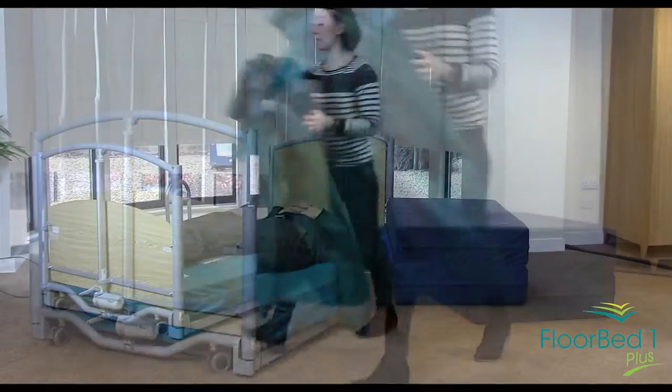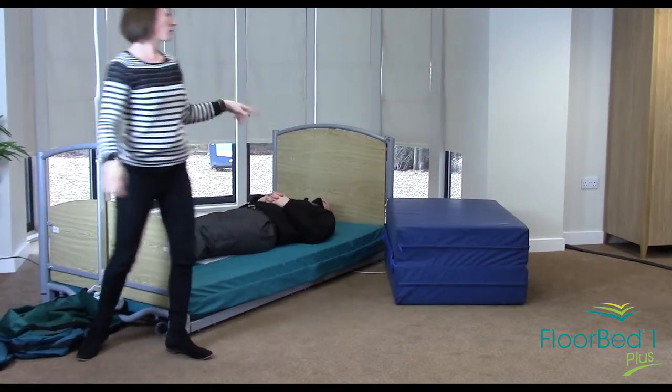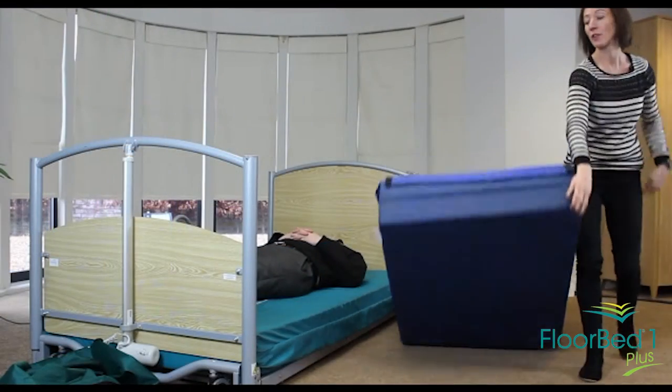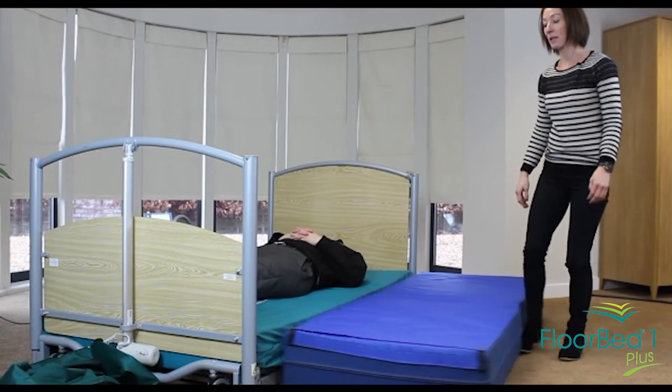If the client is then remaining in the bed, you would want to replace the safety mat next to them so that it's there ready for use should they come out of bed once again.